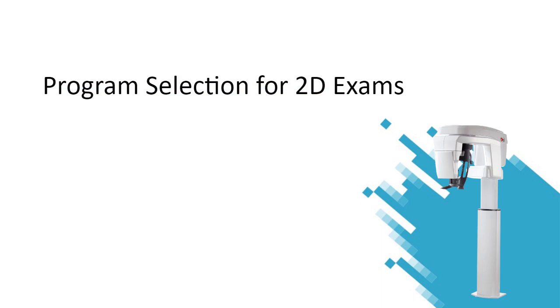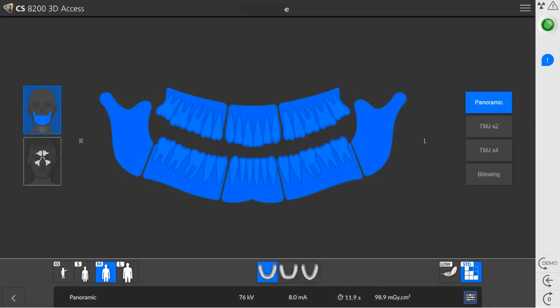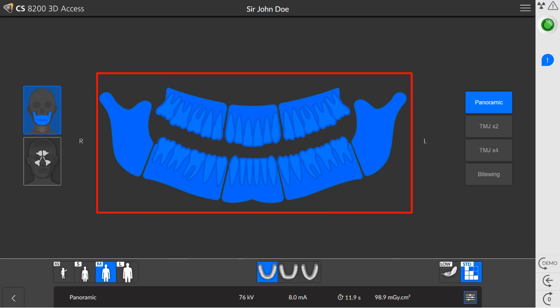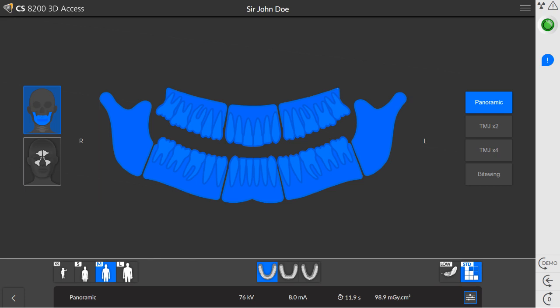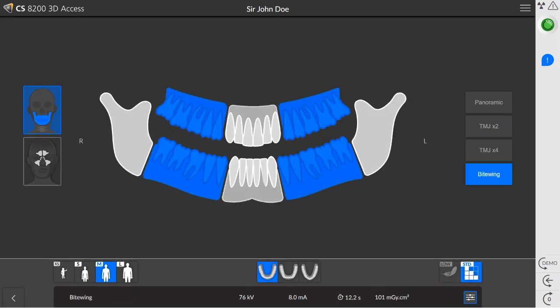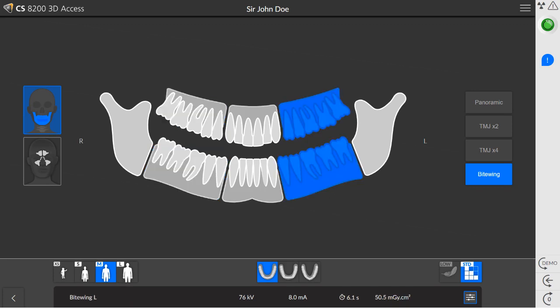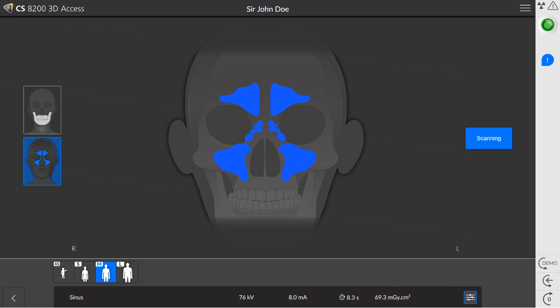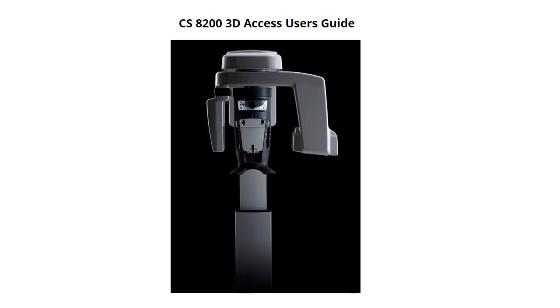Program selections for 2D exams. You can choose between two programs: panoramic or sinus. To perform a panoramic exam, click panoramic and click the area you would like to examine. You can choose from several 2D exams: standard panoramic, TMJ x2, TMJ x4, panoramic without TMJ, and bite wing exam. You can select both bite wings, or you can select the right or left bite wing. To perform a maxillary sinus exam, click Sinus. For an explanation of the radiological exam options, see the CS8200 3D Access Imaging System User's Guide.